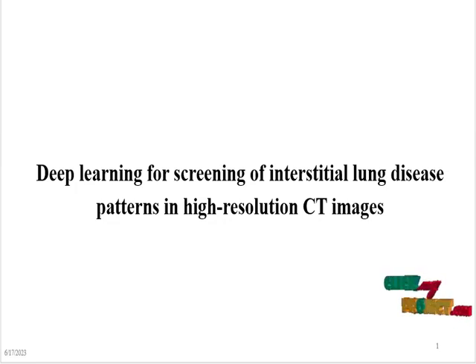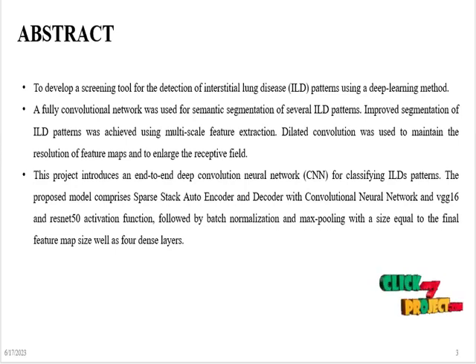Now we are going to discuss deep learning for screening of interstitial lung disease patterns in high resolution CT images. To develop a screening tool for detection of interstitial lung disease patterns using deep learning, a fully convolutional network was used for semantic segmentation of several ILD patterns. Improved segmentation of ILD patterns was achieved using multi-scale and feature extraction.